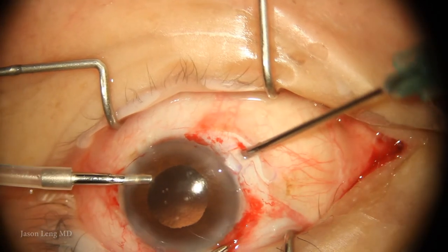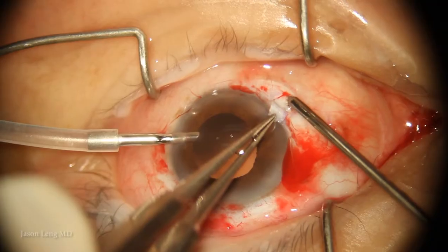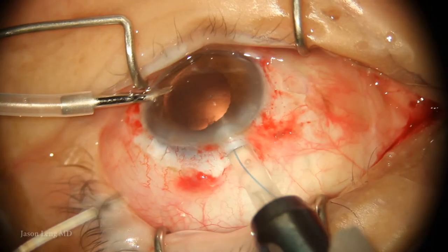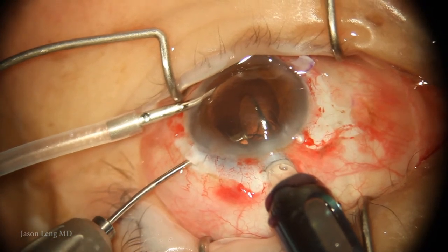Here I'm making a sclerotomy about 1 to 1.5 millimeters posterior to the limbus using a 21-gauge hypodermic needle. I initially used a 20-gauge MVR blade, but I felt a little more secure with the 21-gauge hypodermic needle. And here I'm inserting the lens.